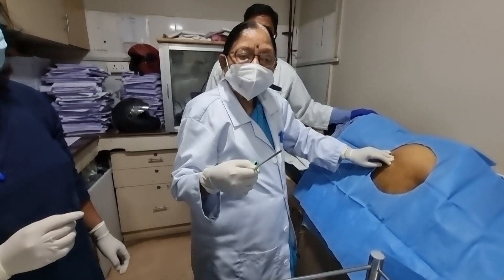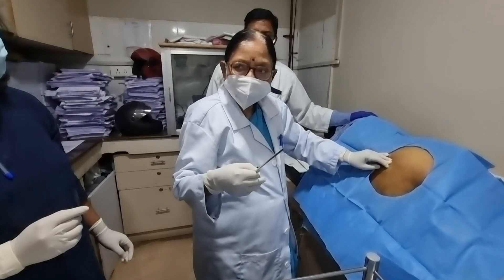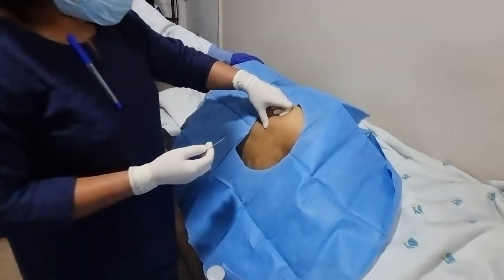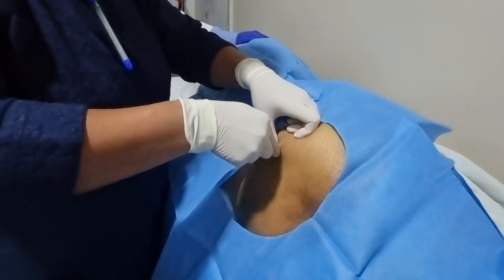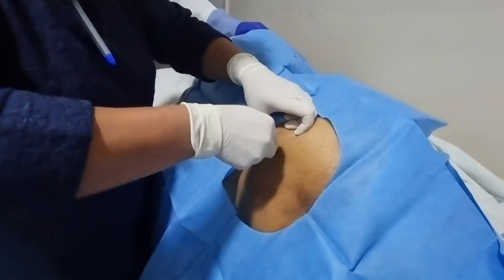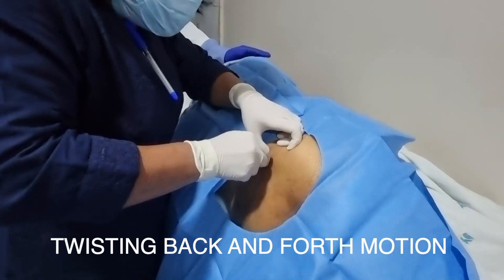Then what you do is process it in histopathology — there will be cutting and you can see how the distribution of these cells is and how it looks.